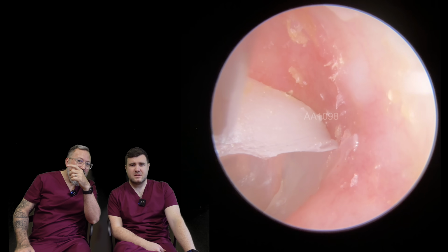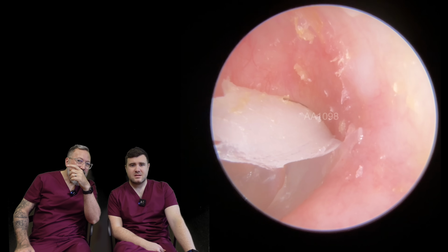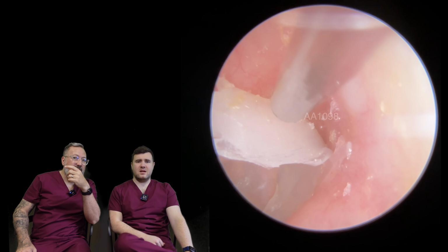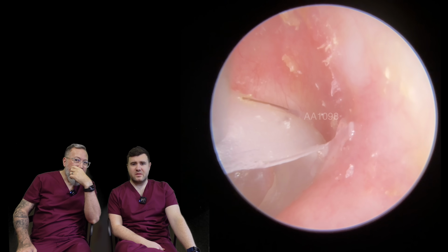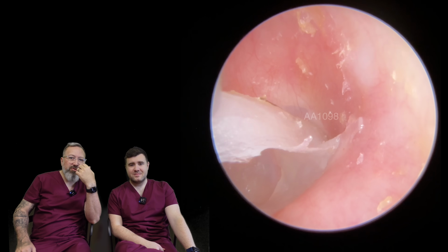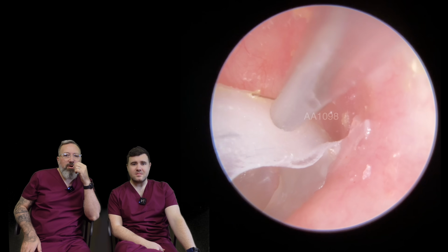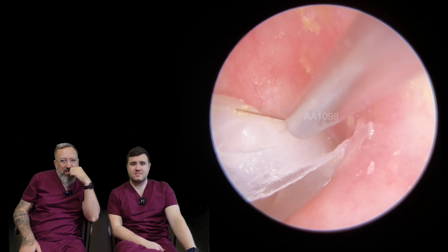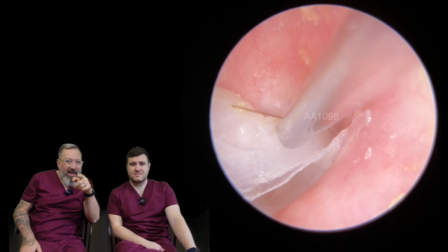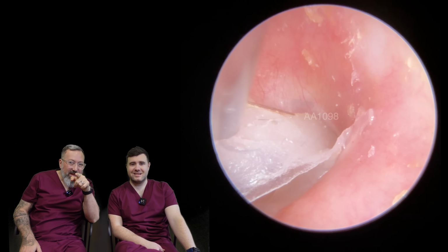Oh, wow. Yeah, look at that. So no wonder this poor patient was having real difficulty with their hearing. They basically had a silicone earplug stuck to their eardrum. Been giving that a good go as well. Yeah. To get it down that far, he was like, I tried to get it out with a cotton bud, but I think I just made things worse. And I was going, yeah, you've kind of shoved it up against your eardrum. A bit of hair stuck to the back of that as well. So they took it all down there.